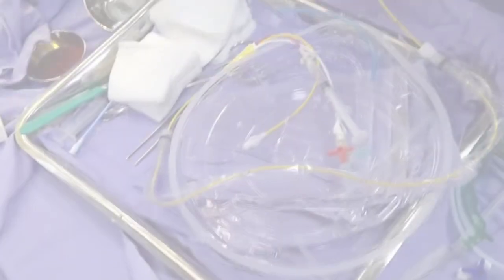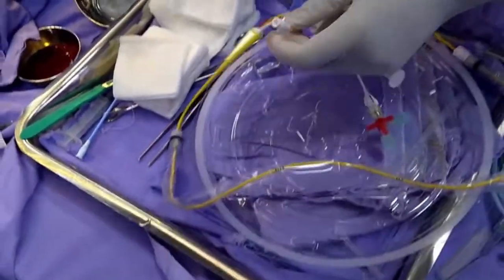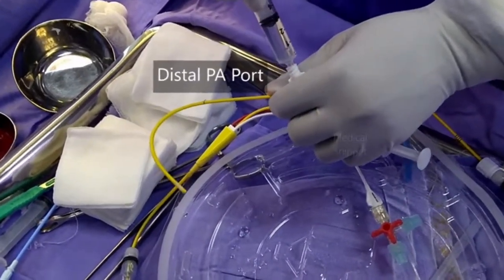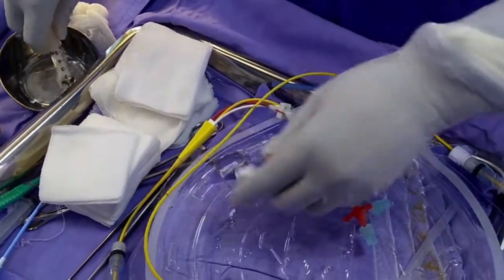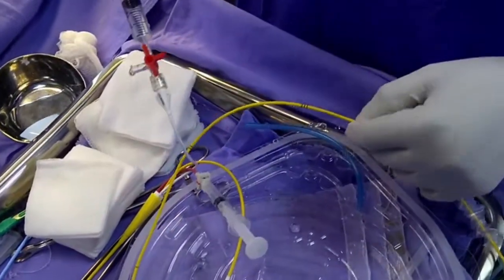It terminates at 31 centimeters. Here we're preparing for insertion. Prior to insertion, all the ports are flushed. As you can see, we are flushing the distal PA port, and that's the tip of the catheter where the fluid comes out. Then next, we're preparing for the CVP.